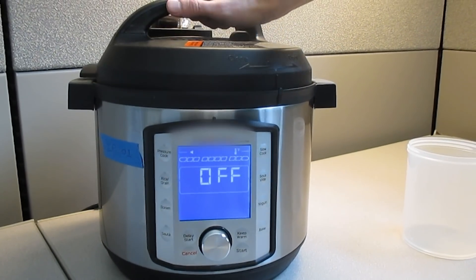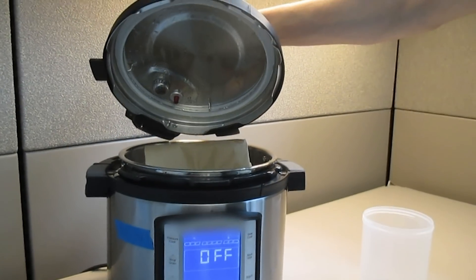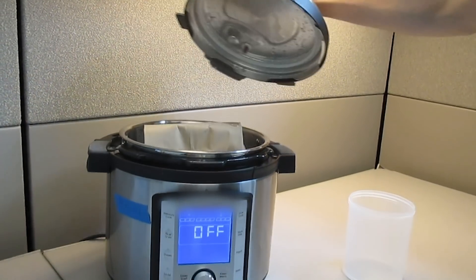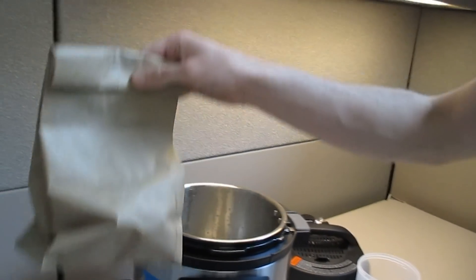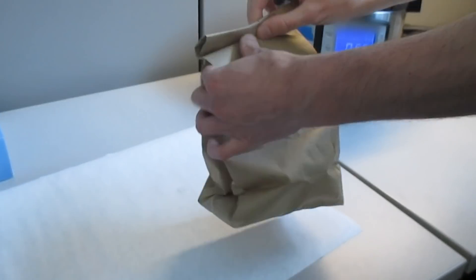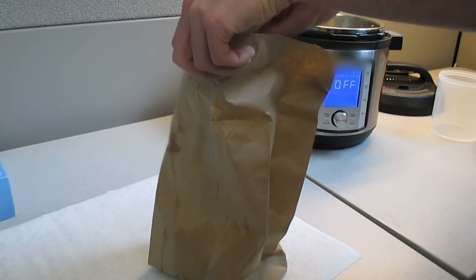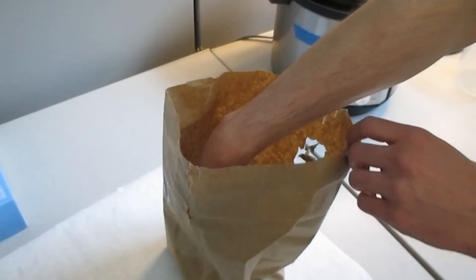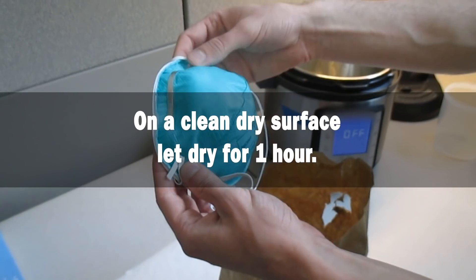Once the cycle is complete, remove the lid following the manufacturer's instructions. Note the contents will not be under pressure when the sous-vide function is used. Remove the paper bag containing the mask or masks from the multi-cooker and open the bag to allow the mask to dry. If multiple masks were placed into the paper bag, then remove them and set them out to dry on a clean dry surface.